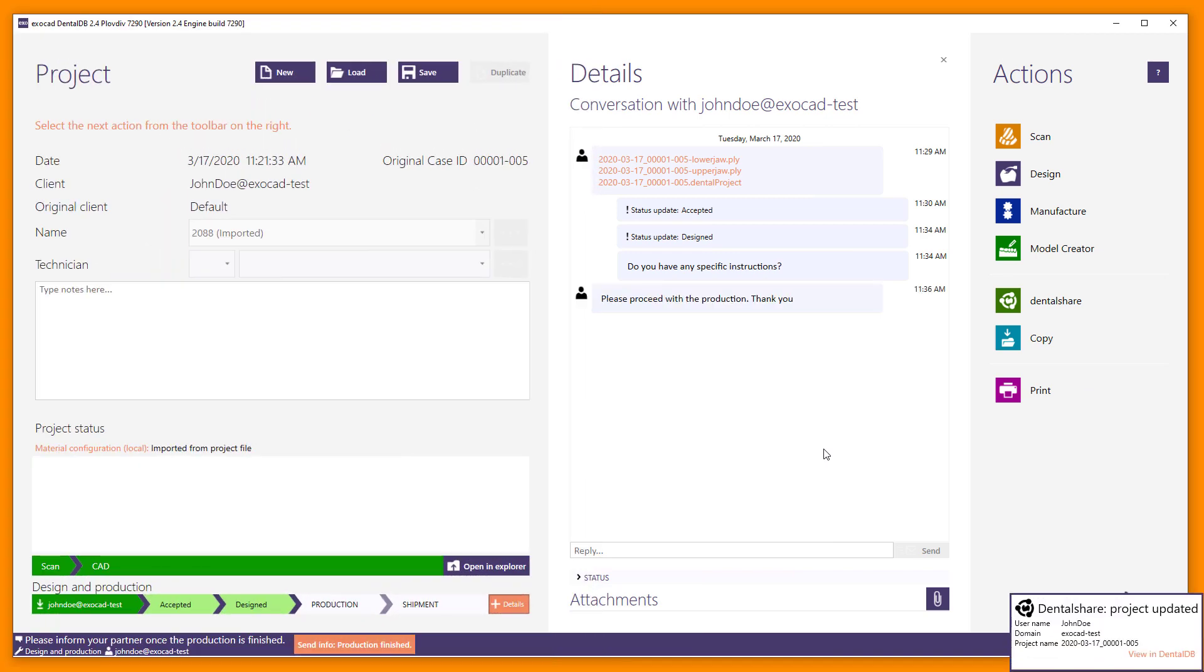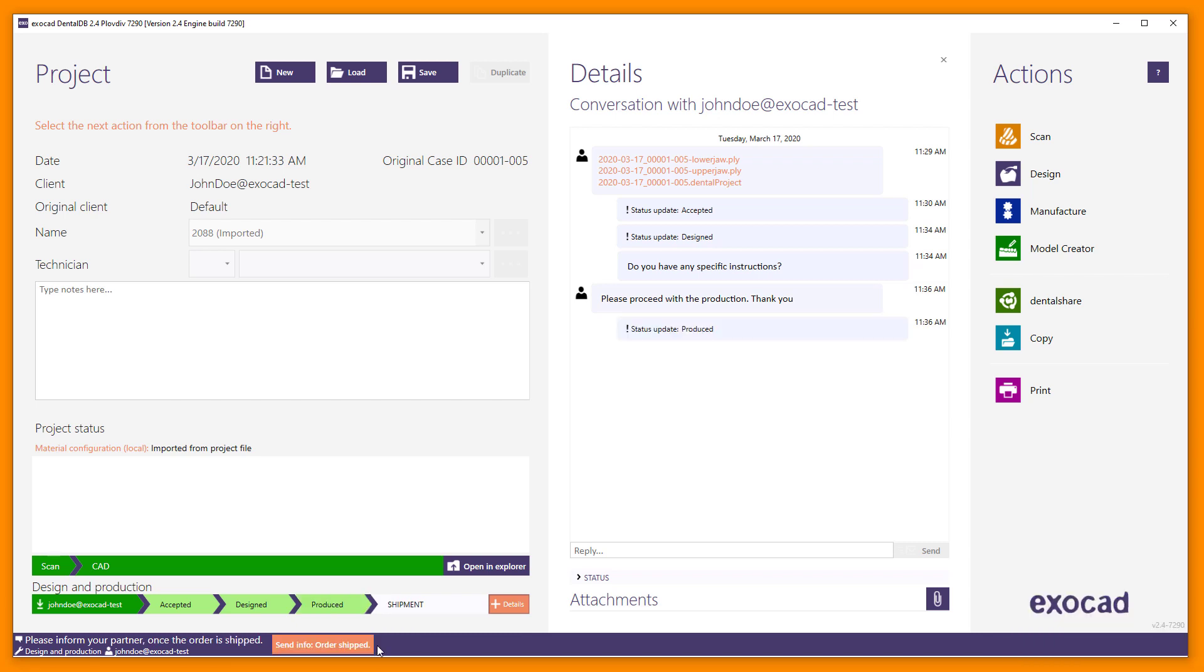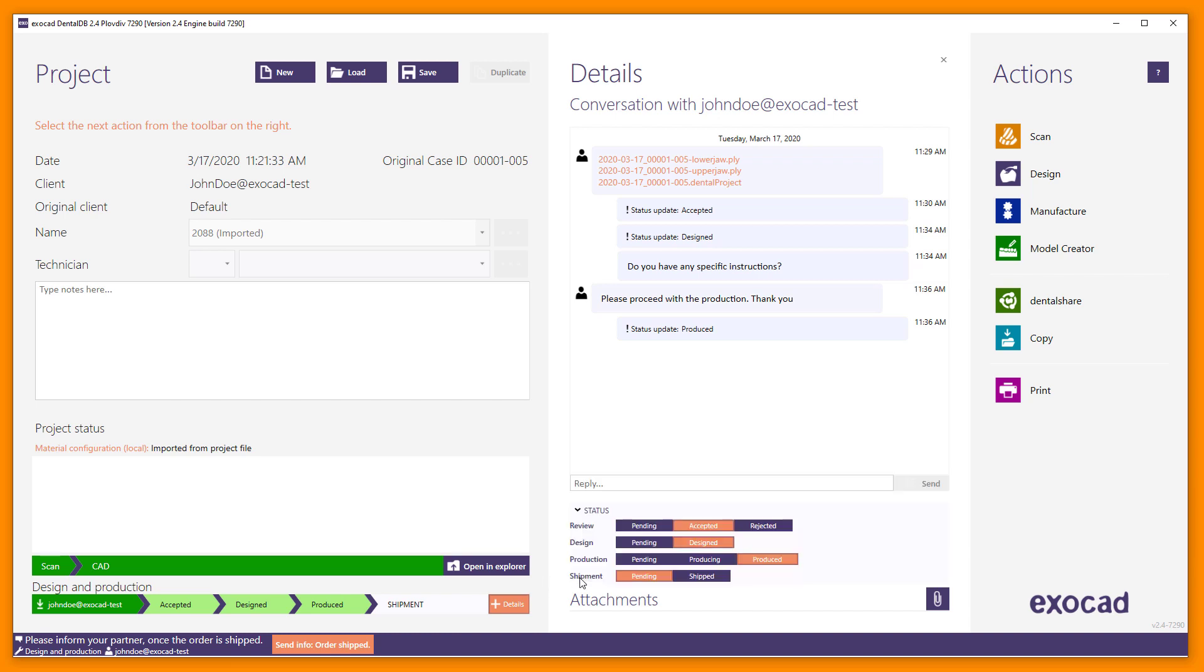By sending the info after the production is finished, the field Production in the status bar will change to Produced.